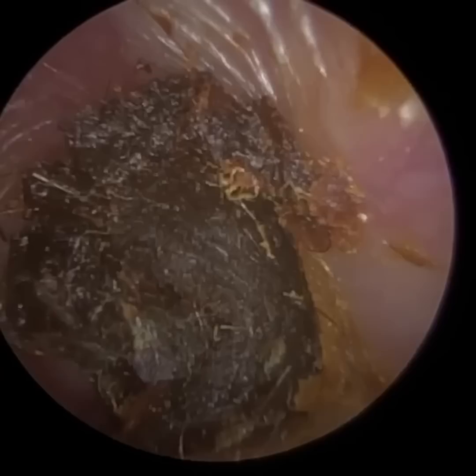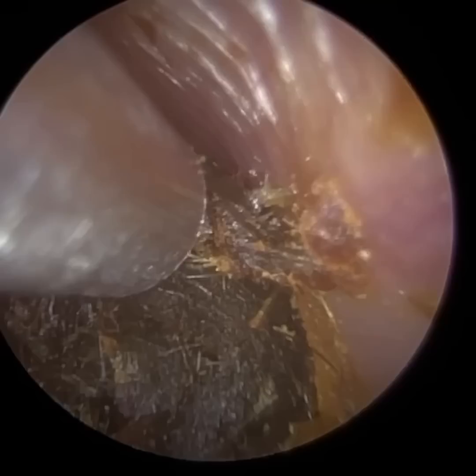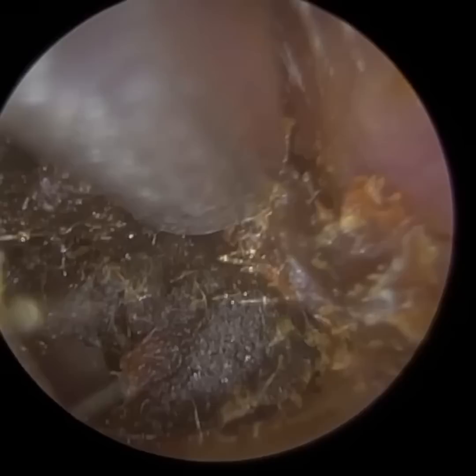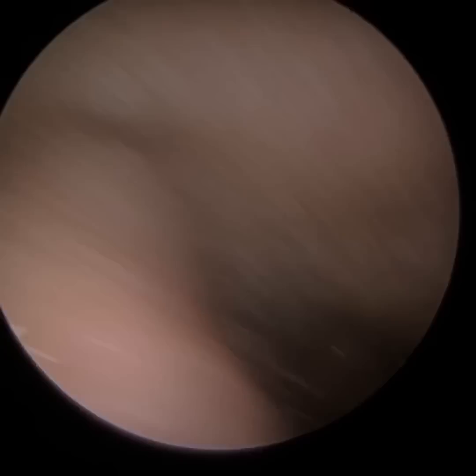Now this patient's ear canal has quite an upwards trajectory. Most people's ear canals, in adults at least, tilt upwards — it's about 30 to 32 degrees, that's the average inclination. And then near the eardrum, it kind of does dip back down again. So fortunately, we managed to remove that in more or less a single piece.